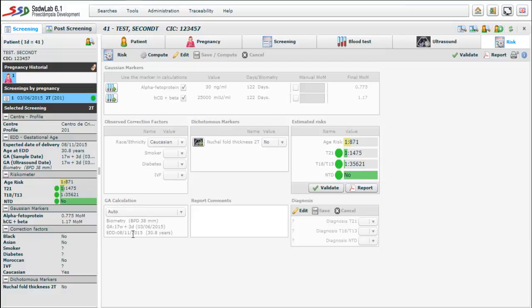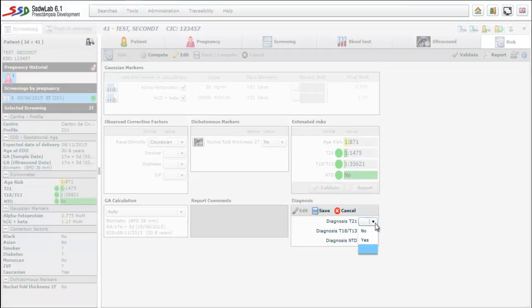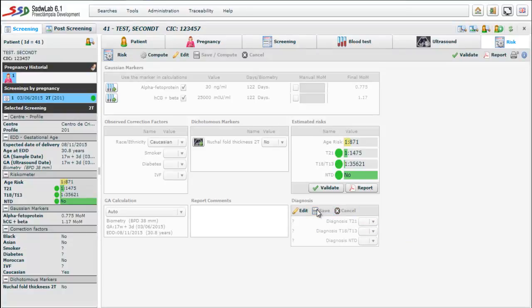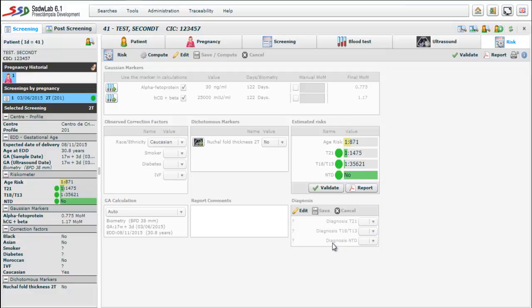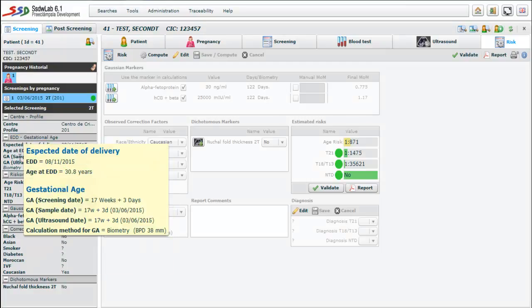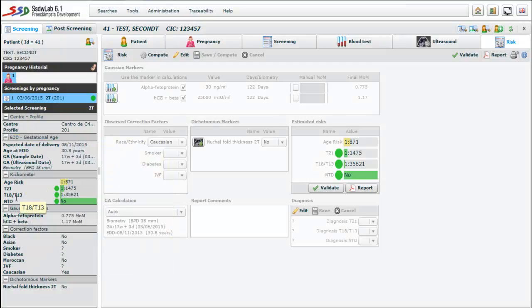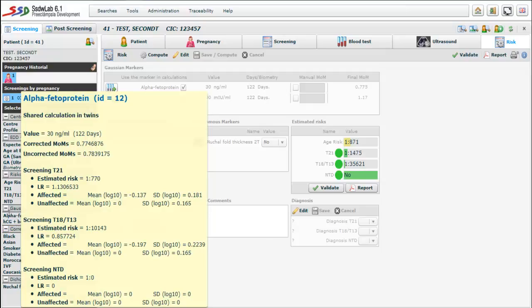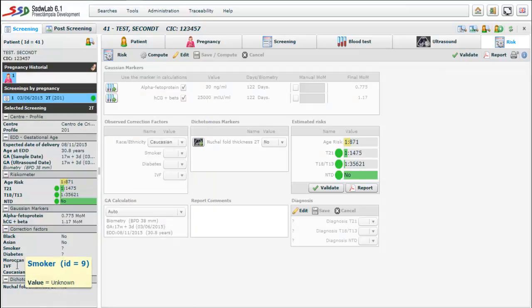In the bottom left of the screen there is information relating to gestational age estimation. In the bottom center there is a box that lets you enter details that will appear in the report. And in the bottom right there is a section that, after completing the relevant tests, we may introduce the diagnostic values: trisomy 21, trisomy 18-13 and neural tube defects. On the left side of the screen there is an informative summary of the patient's screening, where appear the screening date, the center, the screening profile, the gestational age, the risks, the MOMs of Gaussian markers, the correction factors and dichotomous markers if they have been used.